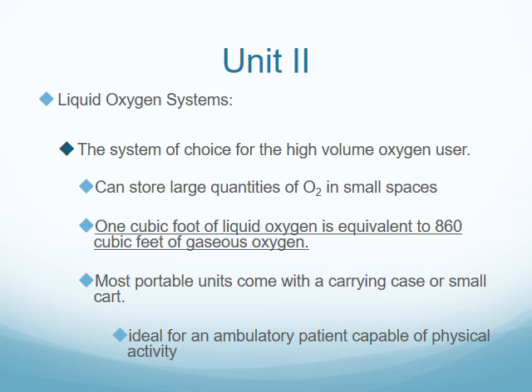The nice thing about this is it can store large quantities of oxygen in small places. As a matter of fact, 1 cubic foot of liquid oxygen is equivalent to 860 cubic feet of gaseous oxygen.